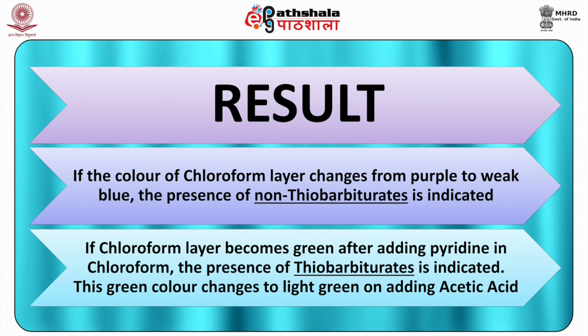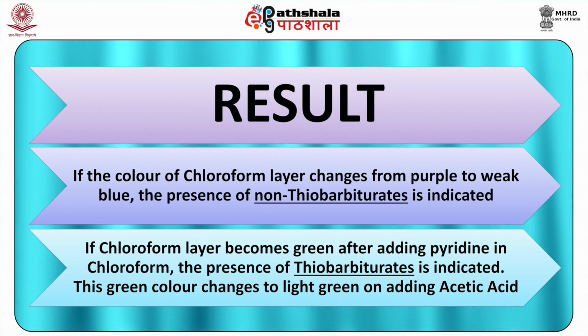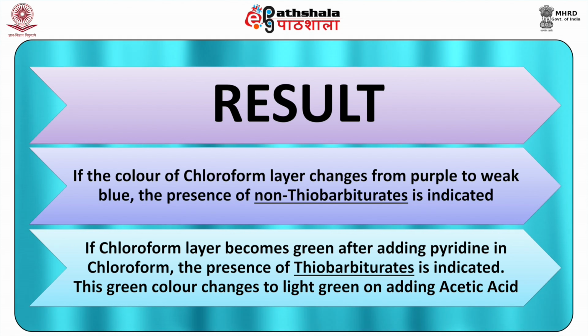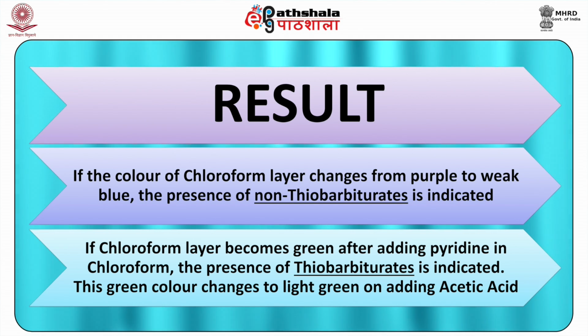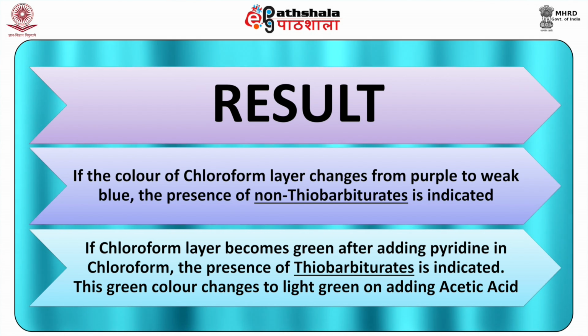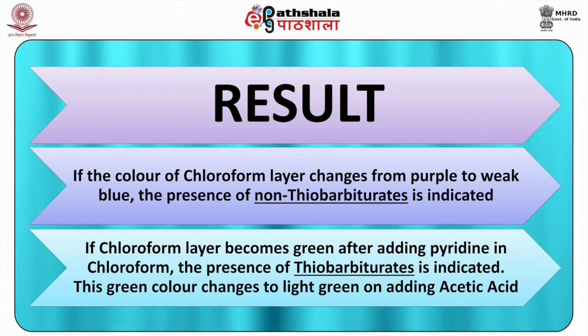non-thiobarbiturates is indicated. If the chloroform layer becomes green after adding pyridine in chloroform, the presence of thiobarbiturates is indicated. This green color changes to light green on adding acetic acid.